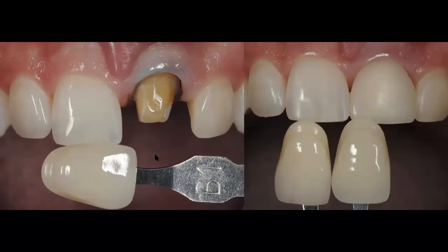So that if they do fabricate a zirconia substrate or a core, they put that core on top of that stump with the actual A4 shade, and they can say, okay, yes, I am hiding the color of the stump. Now I can layer my ceramic with whatever shade we choose, and now it's going to be easier for me to match. And I'll show you how easy this can become a mistake, because there was a mistake made for this particular case. So I'll share that with you.